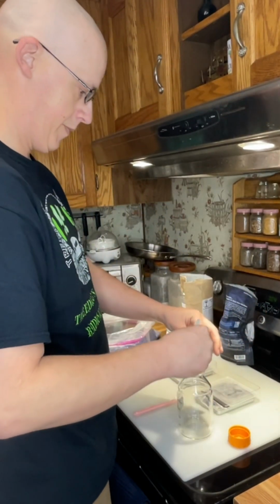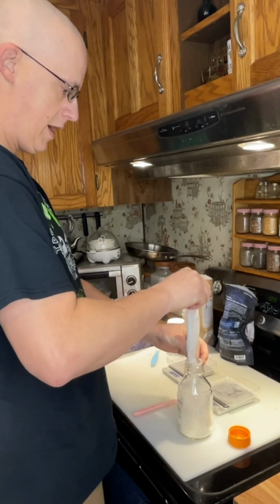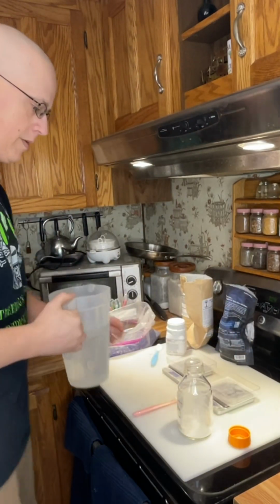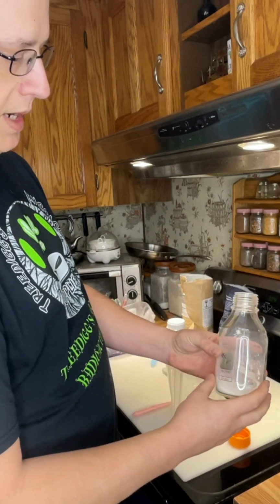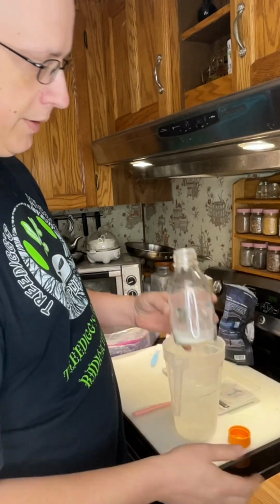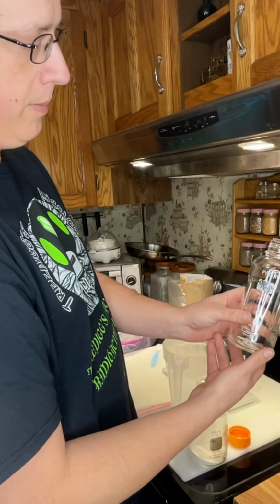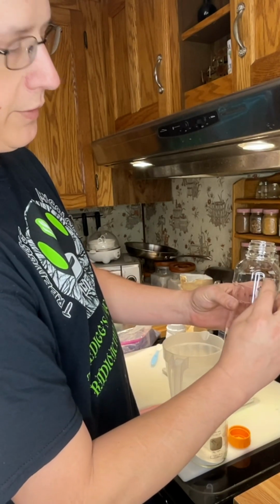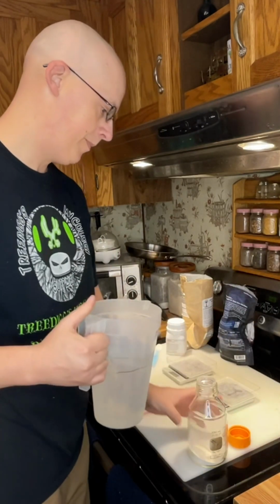All right. We'll go ahead and get our powder in there like normal. And we're going to do this as quick as we can. If you don't know, on these little wide mouth 500 milliliter Pyrex, this little line is your 500 mark, so it's real easy to hit. If you're using these other slim lines, they have a 500 here, but on the other side, the top of the Pyrex is also your 500 milliliter mark. So good reference to remember.